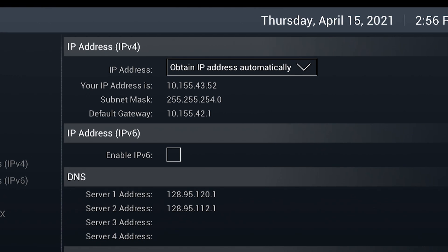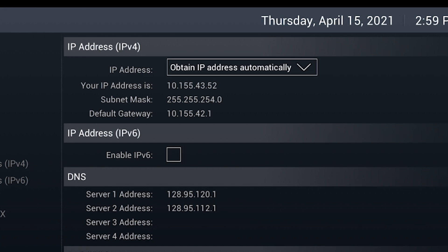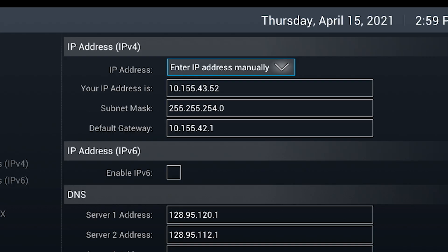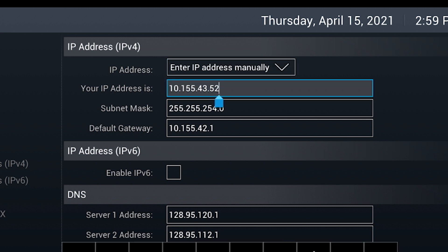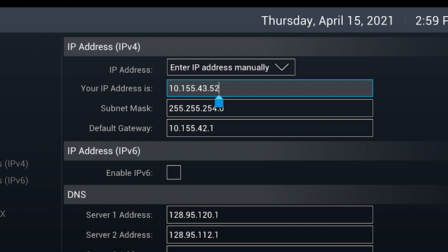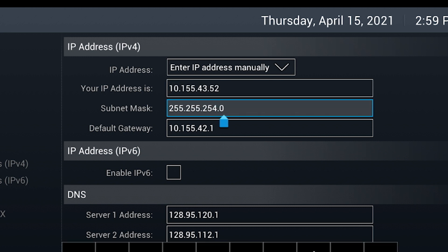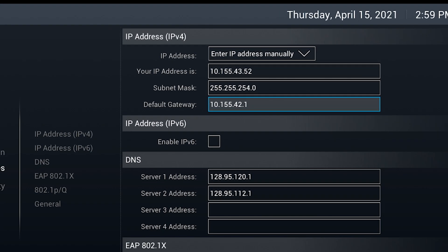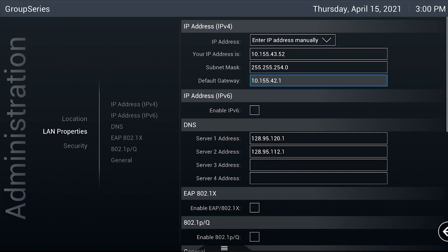Under the IP address, IPv4 section, use the IP address drop-down box and set it to enter IP address manually. This will allow the fields to be edited. Enter your static IP information, including the IP address, subnet mask and default gateway. When finished, tap the back arrow at the far left of the screen until the main screen.